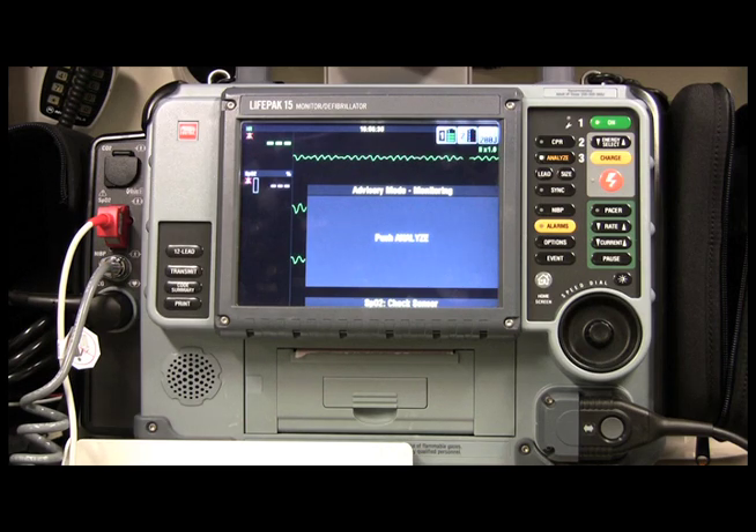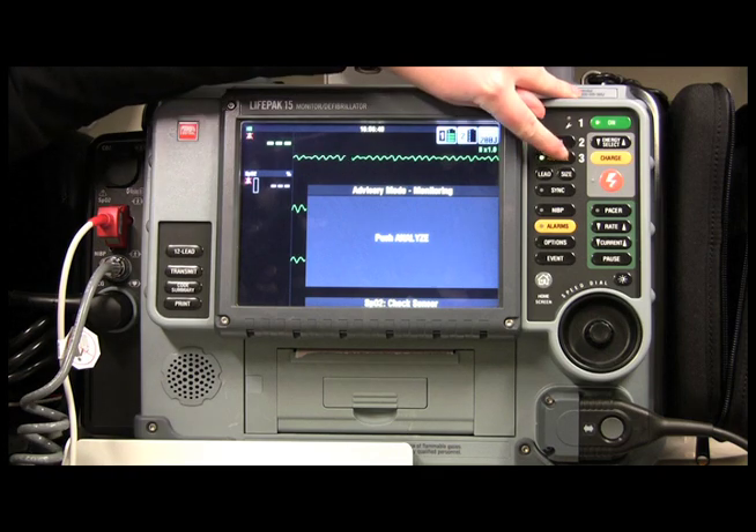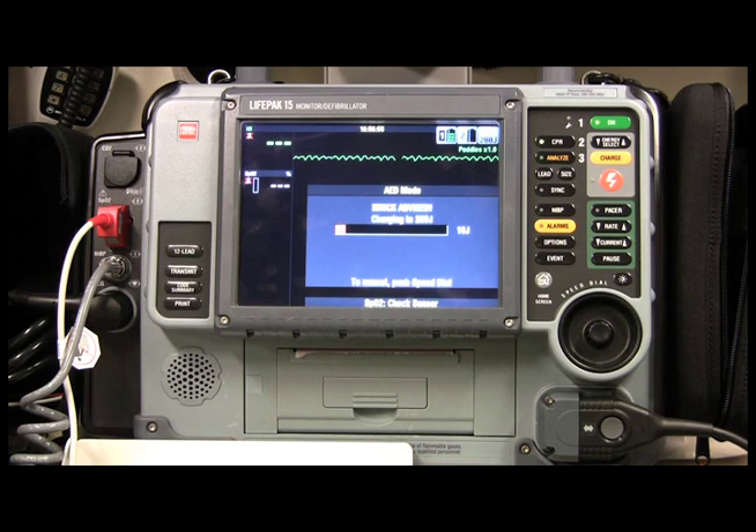The computer recognizes that this is a shockable rhythm and it's asking you to analyze. So what you do is come over to the analyze button right here — analyzing now. Stand clear, make sure everyone is clear of the patient. Shock advised, and it's telling you to go ahead and shock the patient.